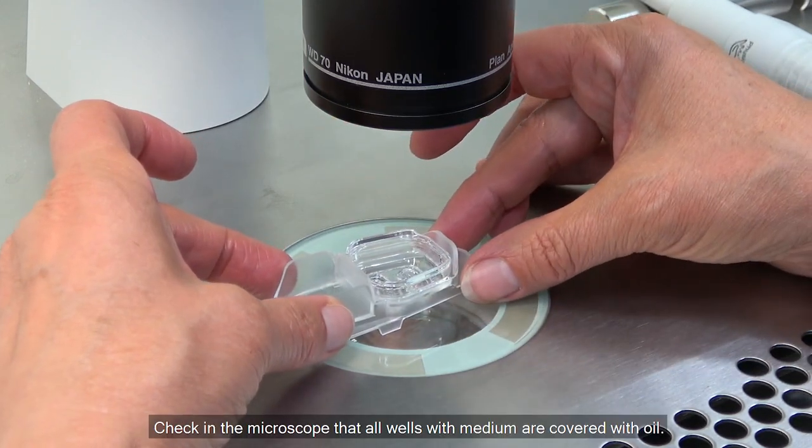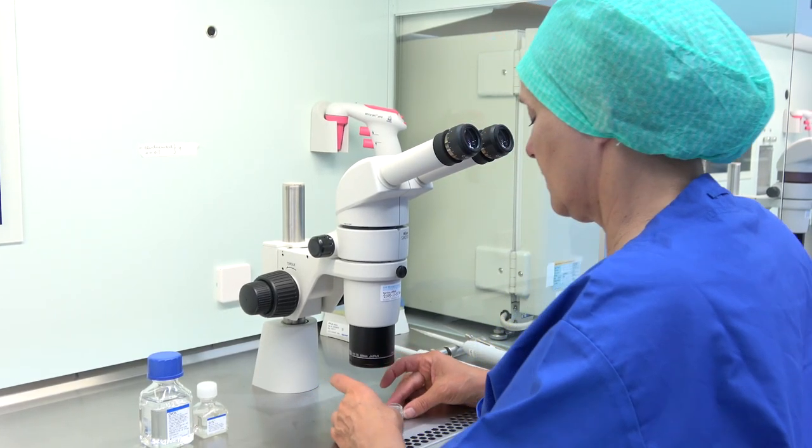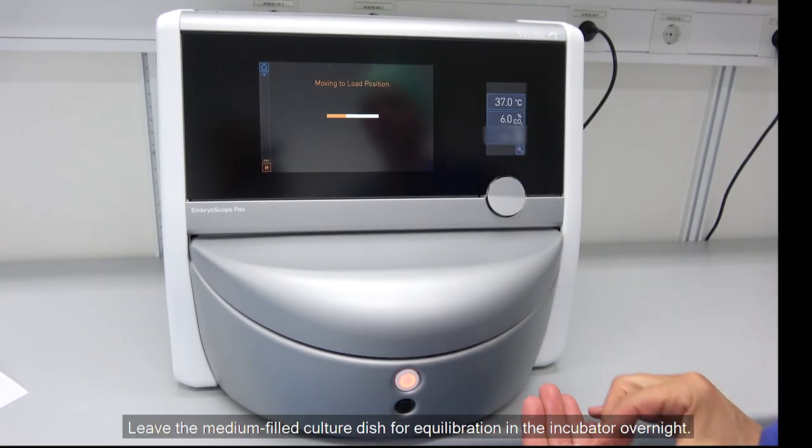Check in the microscope that all wells with medium are covered with oil. Leave the media-filled culture dish for equilibration in the incubator overnight.